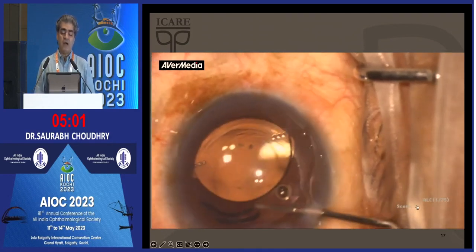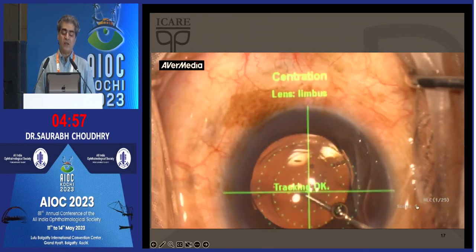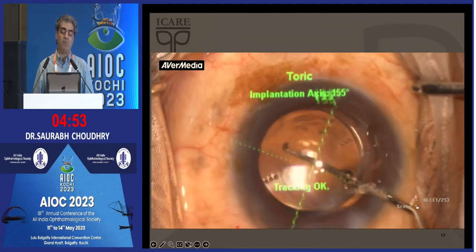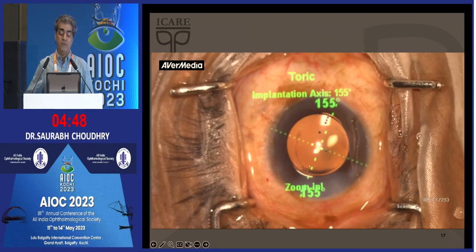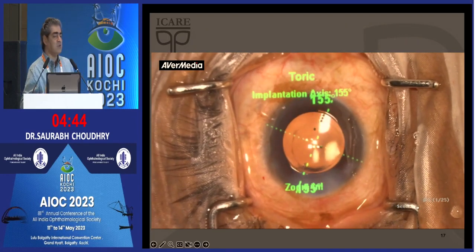And as you implant the IOL, this is an Indian IOL which has been implanted. So you center it, so that's the centering program. It gives you a centration guide, and then it tells you the marks are off by almost 90 degrees, and you move it, and it is exactly falling there. So that's the end of the video, where we're showing that the marks are exactly onto the marks of the IOL.